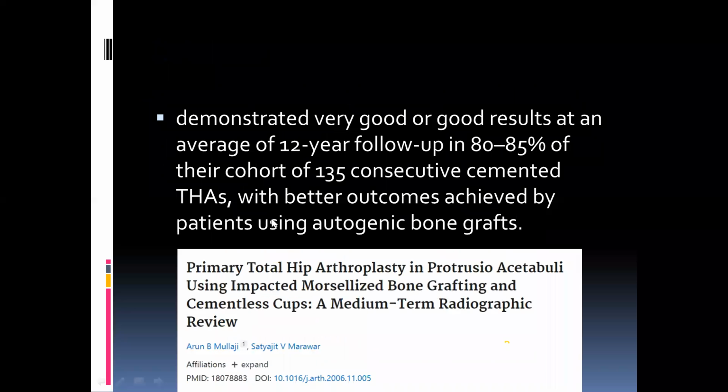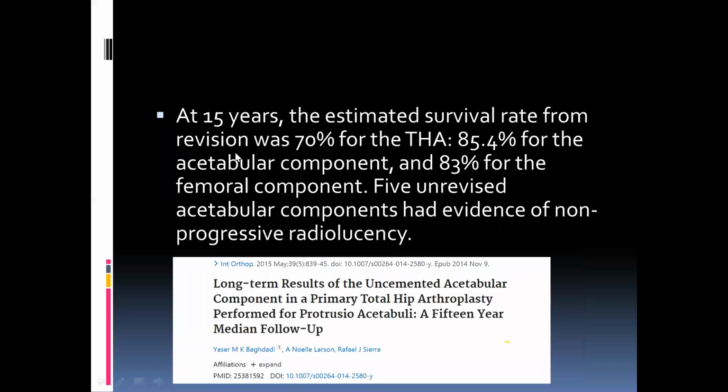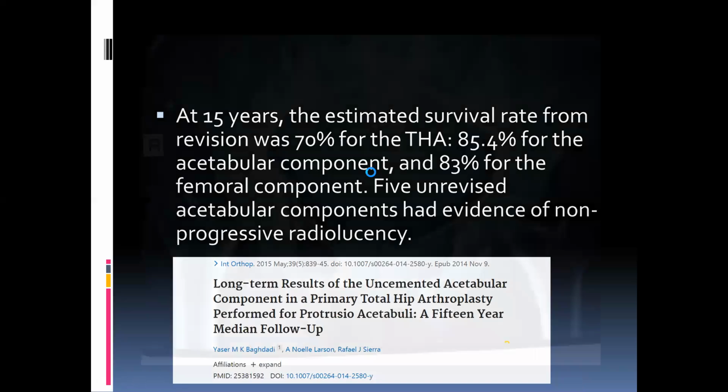Another study has suggested very satisfactory results, from 80 to 85%, in cemented arthroplasty using morselized bone graft. And this one is from Yasser Baghdadi at 15 years follow-up, with another satisfactory result in the acetabular and femoral components.